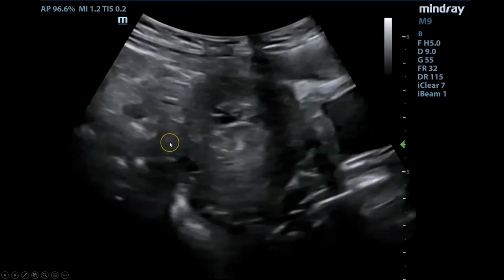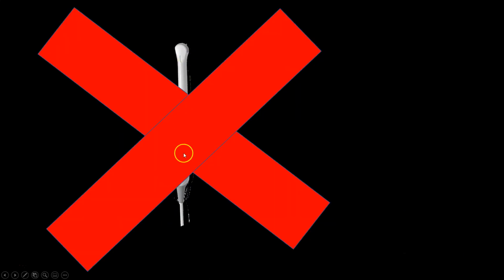Moving on. The one thing we're not talking about today is endocavitary or transvaginal ultrasound. Some of your instructors may be able to go over this with you depending on how much time is left to go over the various topics. It is a topic that I found generally tends to confuse a lot of folks spatially, so we're going to try to keep it to just curvilinear ultrasound for the purposes of this discussion.